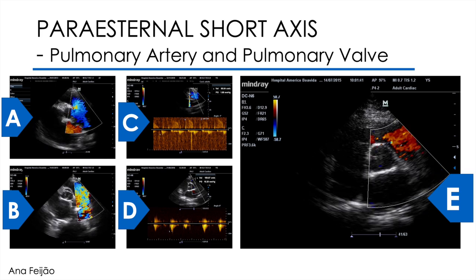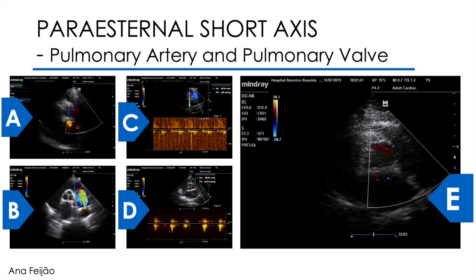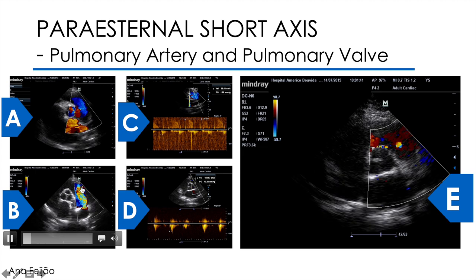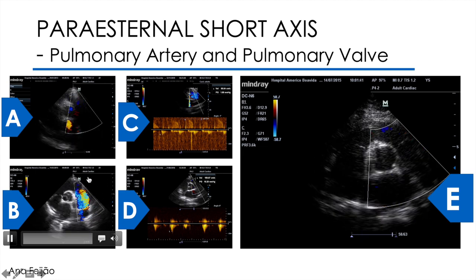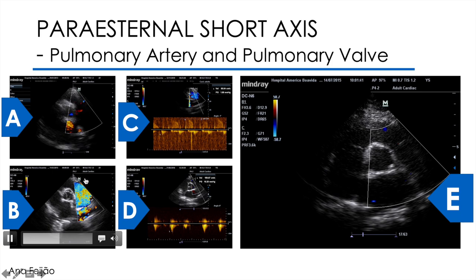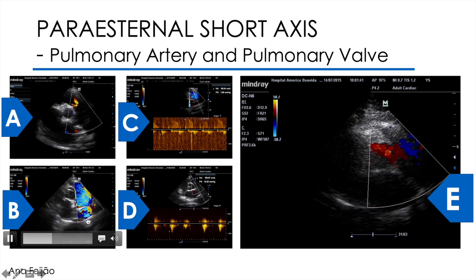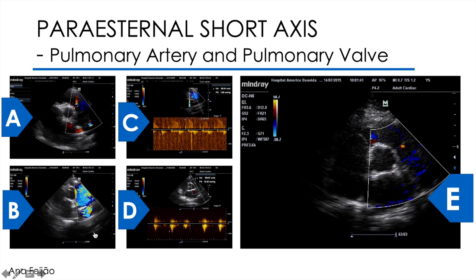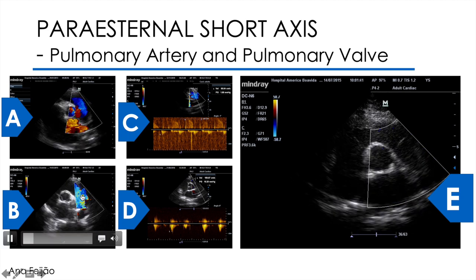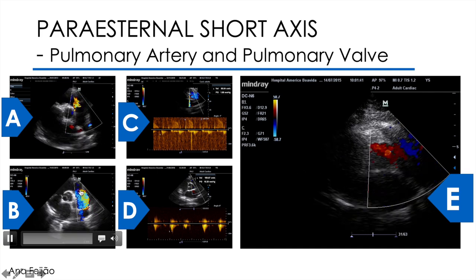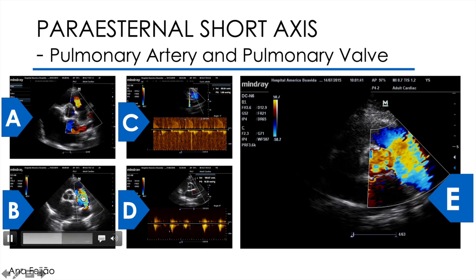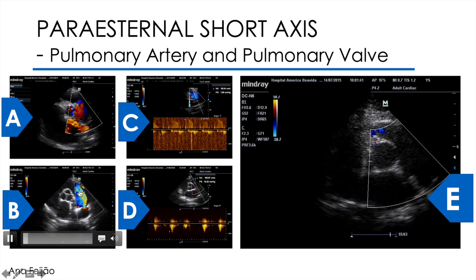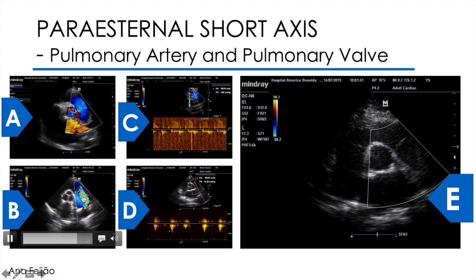We must then place the color window over the pulmonary branch, including the secondary branches, to access the behavior of the flow. We have an example here in the video. We can see a very turbulent flow with an anterior direction going up through the main branch of the pulmonary artery, starting at the level of the bifurcation and which is constant through diastole and cardiac systole. This flow corresponds to a patent ductus arteriosus.